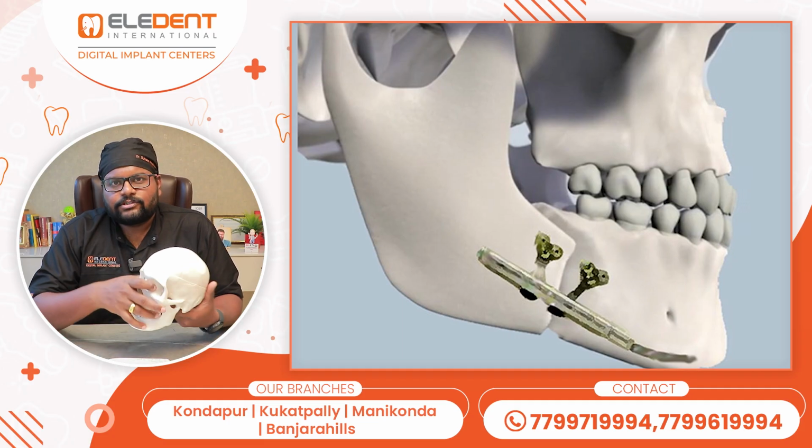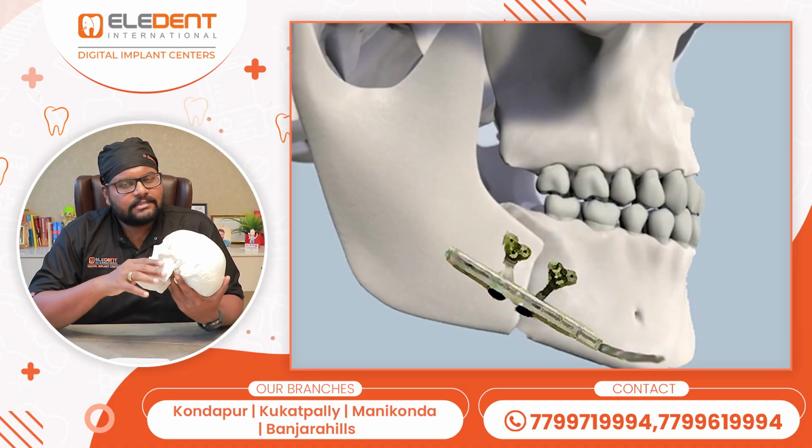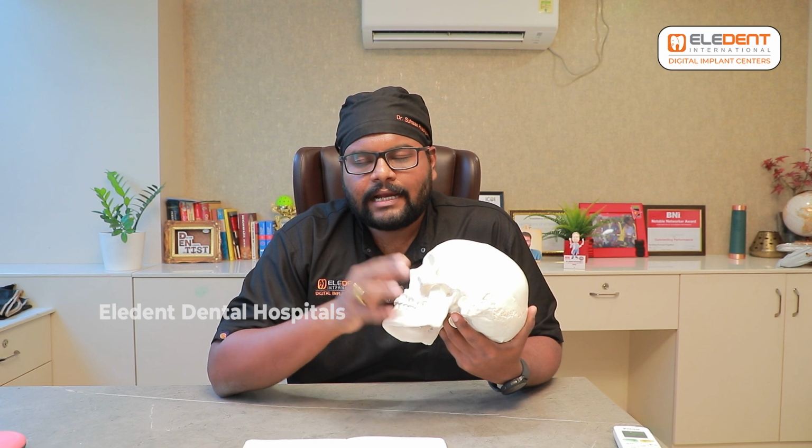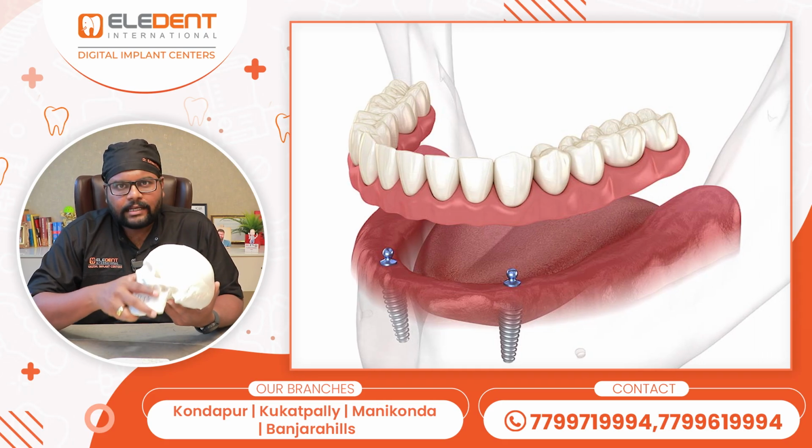Next is distraction osteogenesis, a very invasive procedure, very rare procedure. We cut the bone, separate them by few millimeters as much as required, add bone, wait, and then place implant. Very rare. And finally, overdentures.